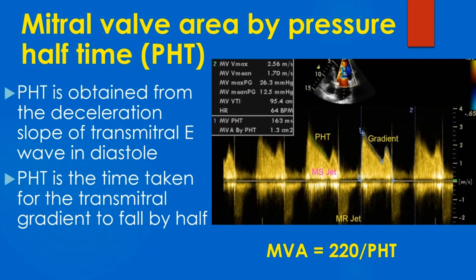In mitral stenosis there is no diastasis. The E wave merges with the A wave, resulting in EA fusion. The green cursor measures the PHT of the mitral stenosis jet. PHT is the time taken for the transmitral gradient to fall by half, or equivalently for the transmitral velocity to fall by a factor of root 2.